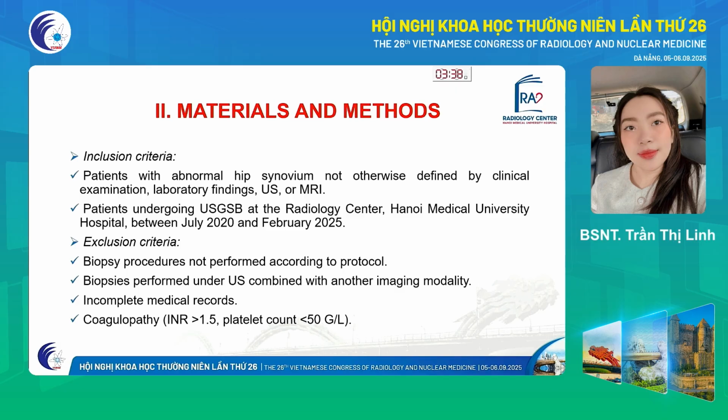About the material and methods, the inclusion criteria: patients with abnormal hip synovium not otherwise defined by clinical examination, laboratory finding, US or MRI, undergoing USGSB at the Radiology Center, Hanoi Medical University Hospital between July 2020 and February 2025.